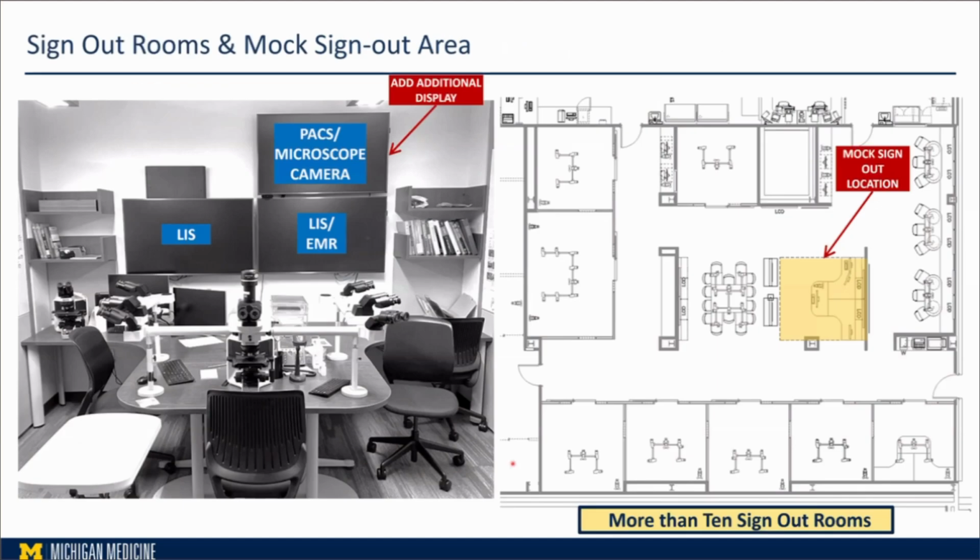From an ergonomics standpoint, we also put into account the mock-up and sign-out design. So we built a mock-up area right now in the center of the multi-headed microscope. This is the area directly next to the wet lab. We have over 10 multi-headed sign-out rooms for different services. And this is the pre-digital workflow.